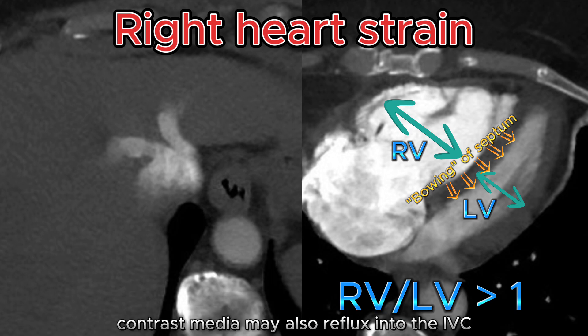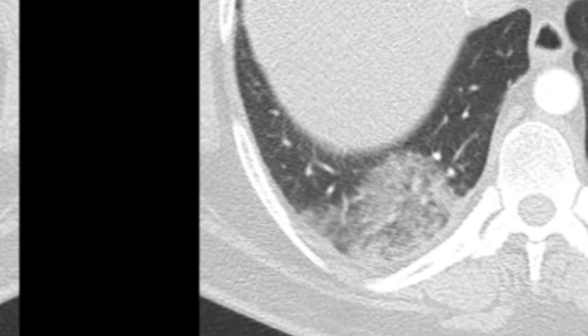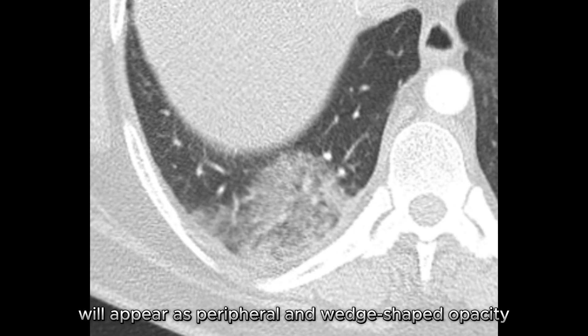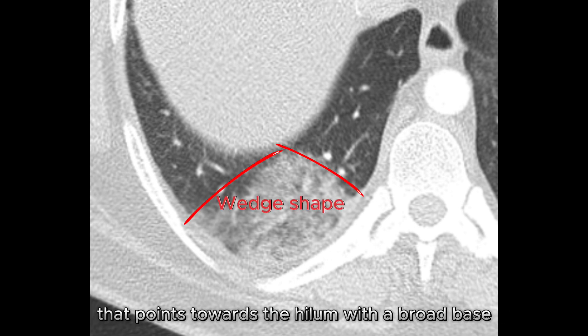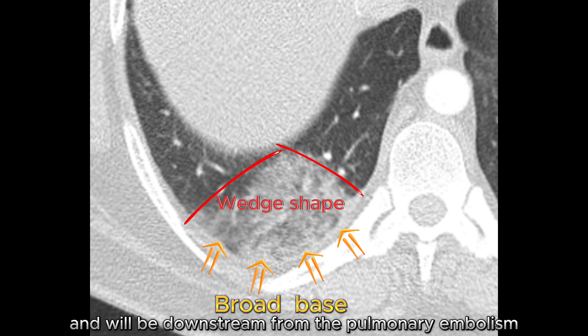Contrast media may also reflux into the IVC and hepatic veins. A pulmonary infarct will appear as a peripheral, wedge-shaped opacity that points towards the hilum with a broad base. This is commonly seen in the lower lobes and will be downstream from the pulmonary embolism.